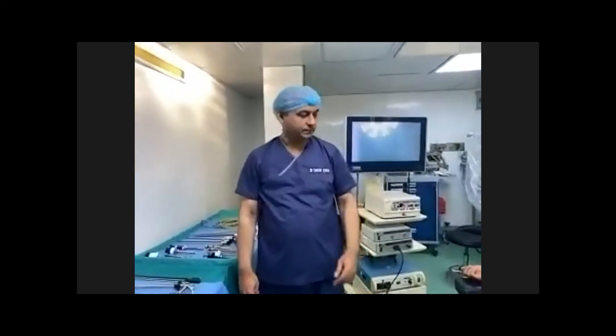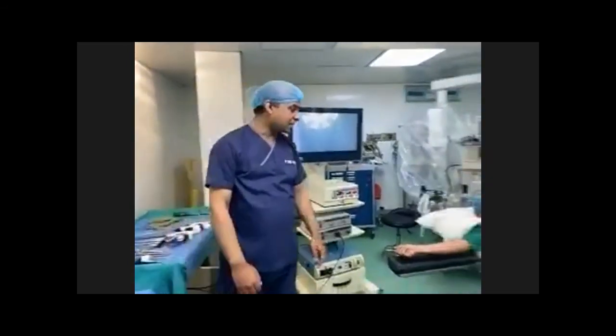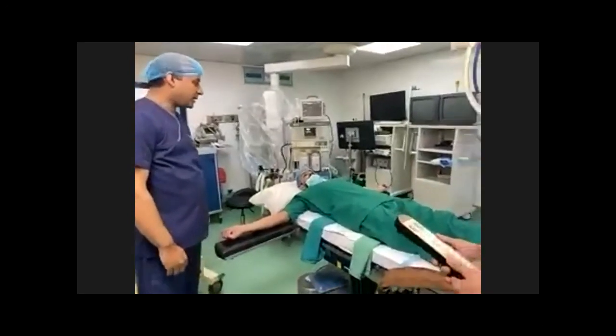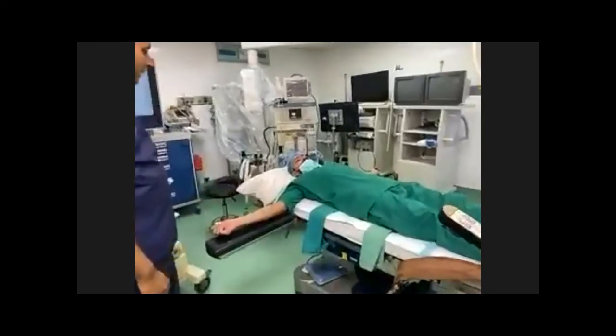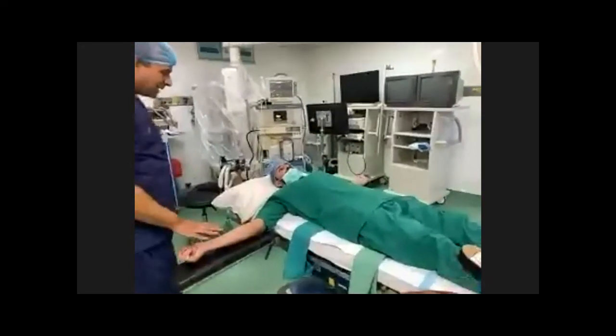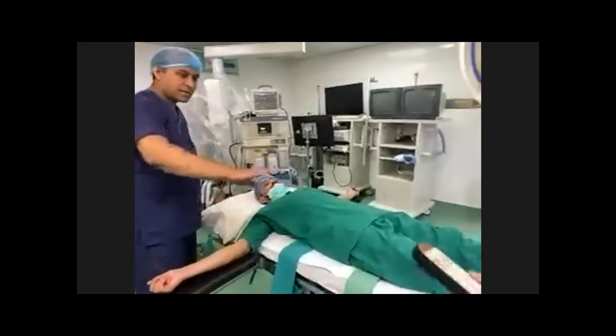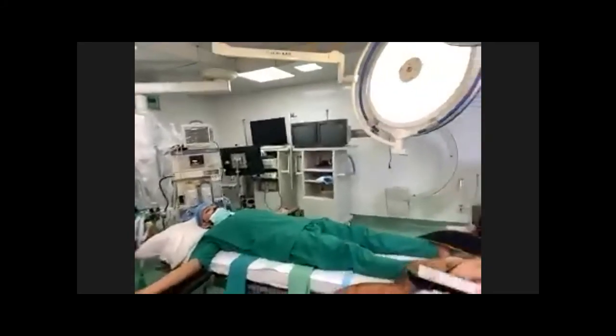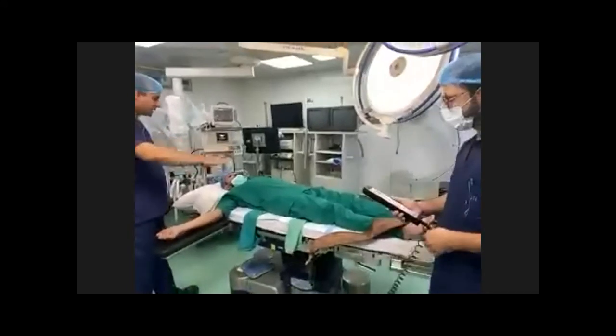It will give you more space on both sides, and your assistant and the whole team will find it easier to perform the procedure. First of all, we thank our colleague who has volunteered to be a patient. Now this is basically a supine position. As you can see, you can go back and give a panoramic view. So this is a supine position.